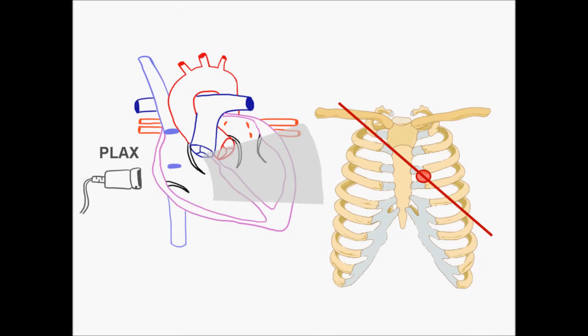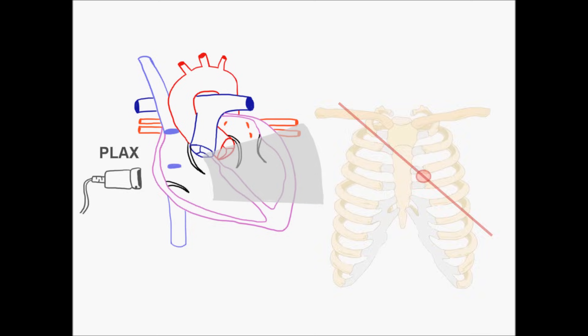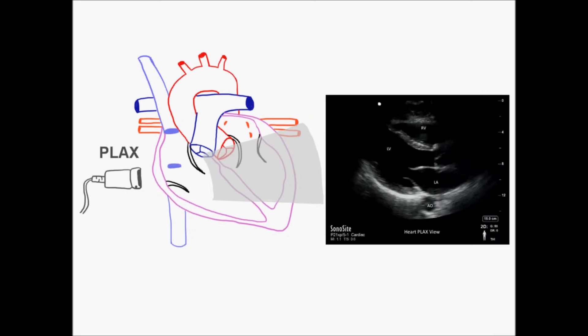We use the phased array probe in cardiac mode, placing the probe at the left sternal border in the third to fifth intercostal space, and orienting it along the long axis of the heart, which runs between the right shoulder and the left hip. Place the probe indicator opposite the screen marker, and you'll get a view showing the right ventricle, the left atrium, the mitral valve, the left ventricle, the left ventricular outflow tract, and the aortic valve.